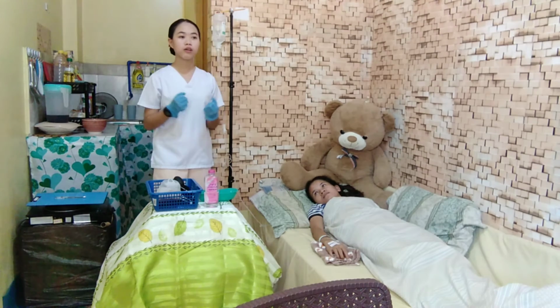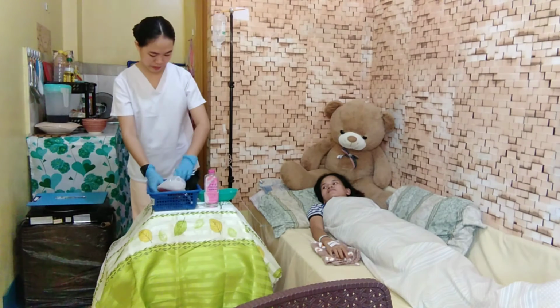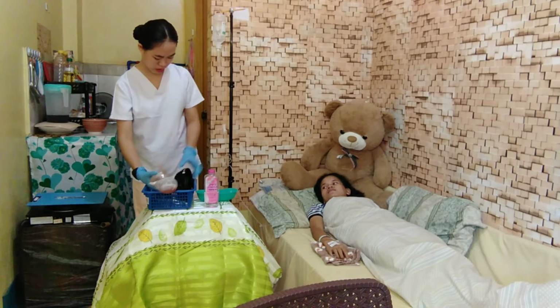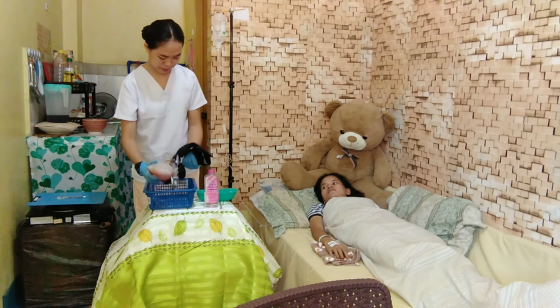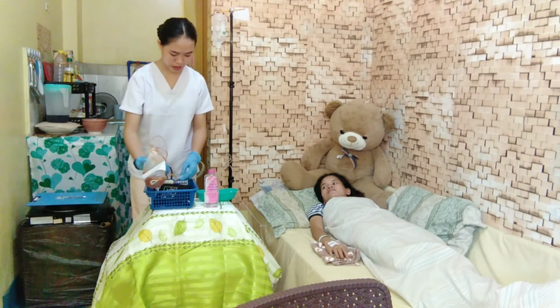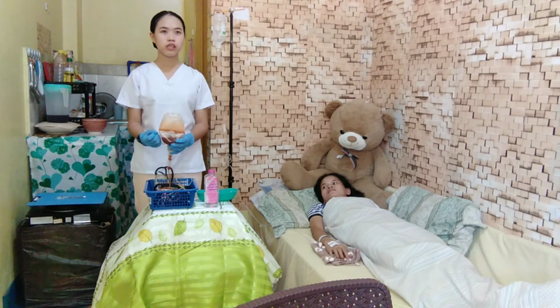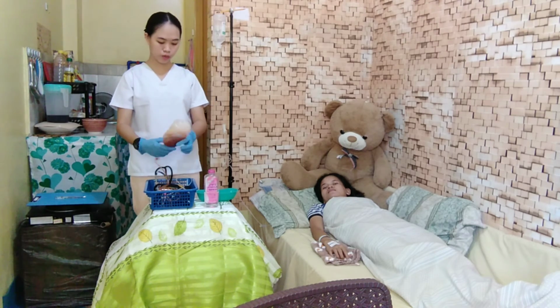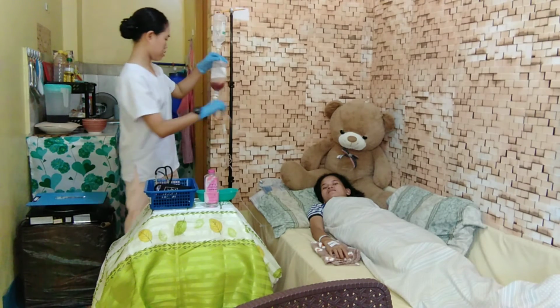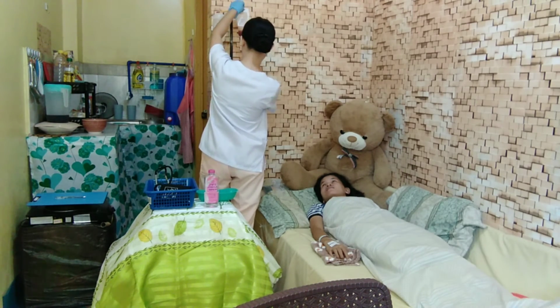We will now open the sterile package of the blood bag. After that, I already attached the set of the blood. We will start the infusion slowly. We are going to transfuse the blood. So I'm going to attach it here. We will administer the blood.